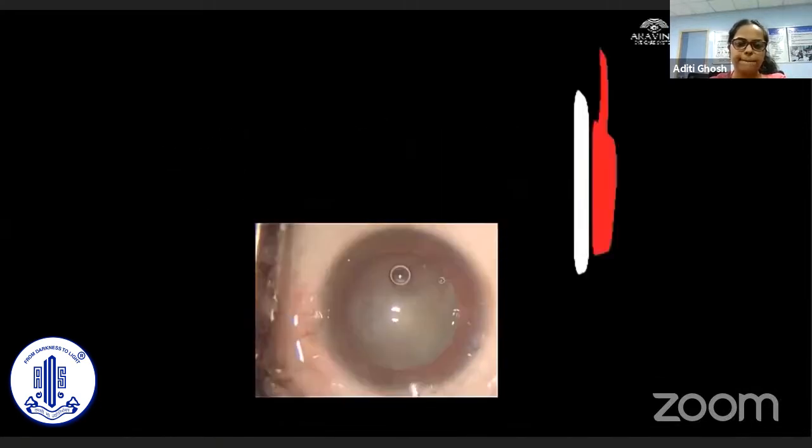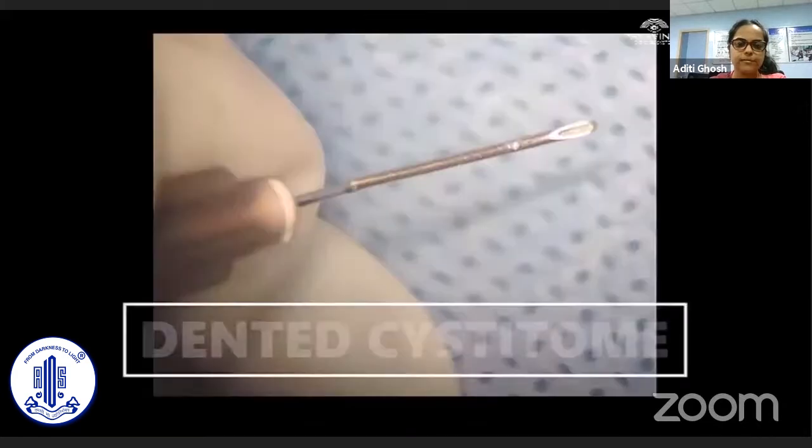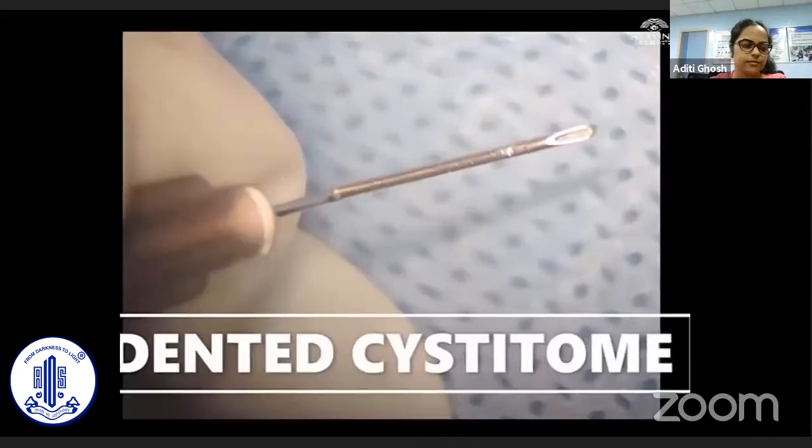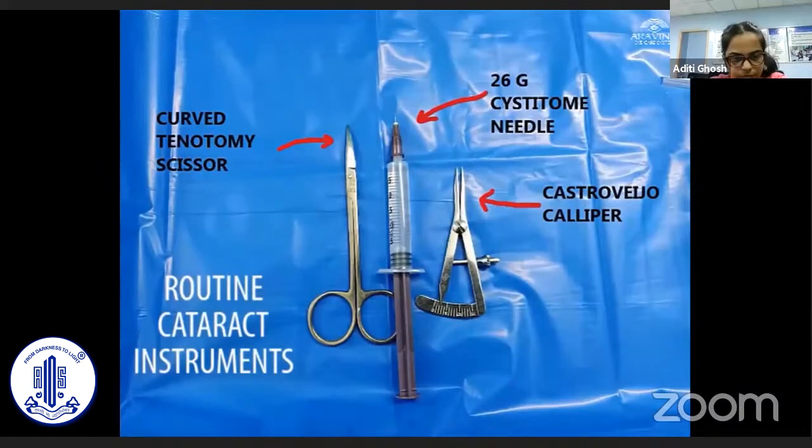Our answer is yes, we can. We introduce our innovation: the dented cystitome. Its preparation requires a curved tenotomy scissor, a 26-gauge cystitome needle, and Castroviejo calipers, which are routinely available in any ophthalmic surgical setup.